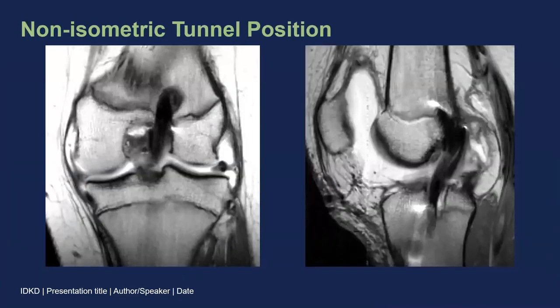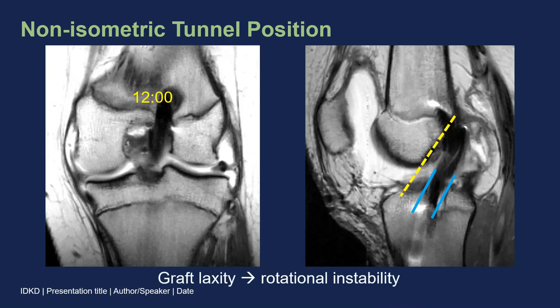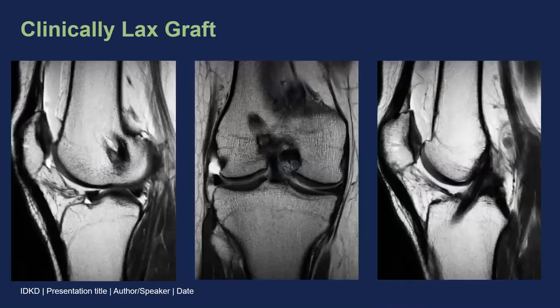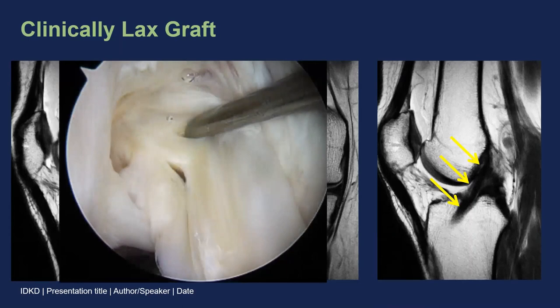Non-isometric tunnel position can be a problem for a few reasons. In this example, the femoral tunnel is at the 12 o'clock position, and the tibial tunnel is well posterior to Blumensatz line. That combination means the graft will be relatively vertically oriented, which can lead to graft laxity or even rotational instability. In another patient, the femoral tunnel is too far anterior and superior, and clinically this patient had a lax graft, even though it looks perfectly normal on MRI. At arthroscopy, that graft was lax and incompetent and needed to be revised — so we can't always determine graft laxity on MRI, but we can accurately assess tunnel position.